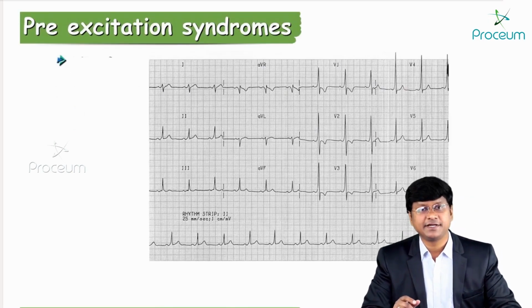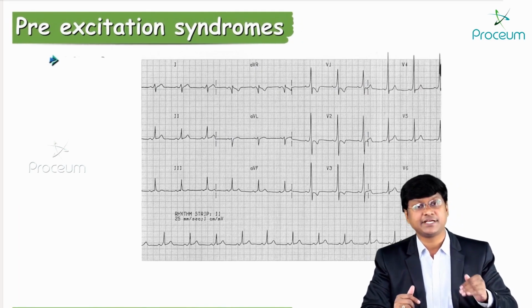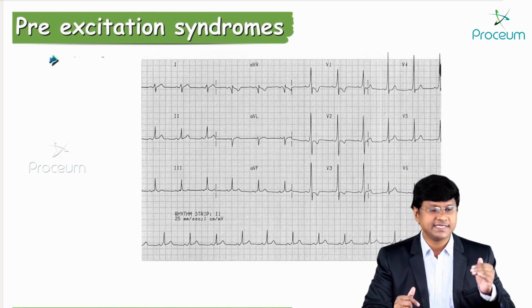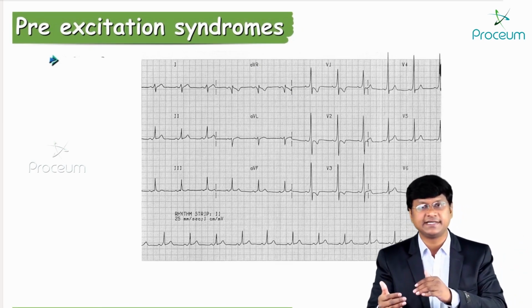Now, if you take this particular ECG, let me tell you that the present classification of the pre-excitation syndromes is, like I have just shown you, left-sided pathways and right-sided pathways.